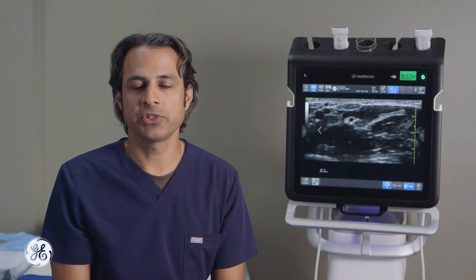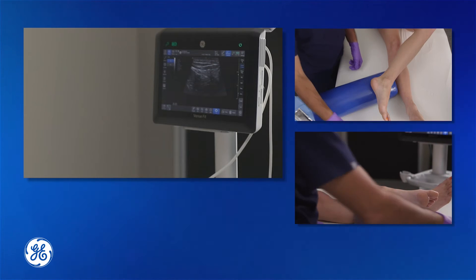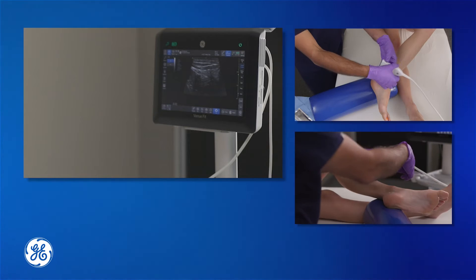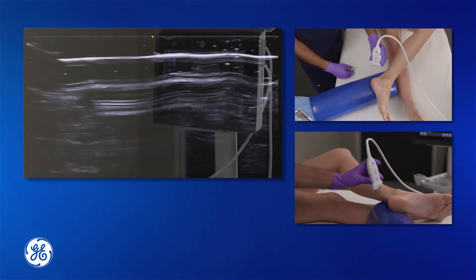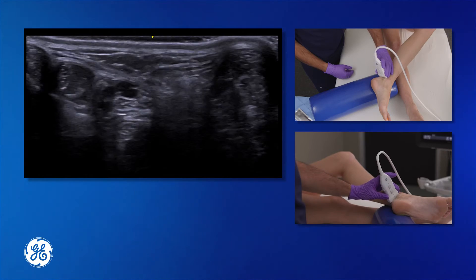In this video we'll demonstrate how to perform a posterior tibial nerve block to anesthetize the sole of the foot. Using a linear-ray transducer with an ultrasound, scan the area behind the medial malleolus looking for the posterior tibial nerve.